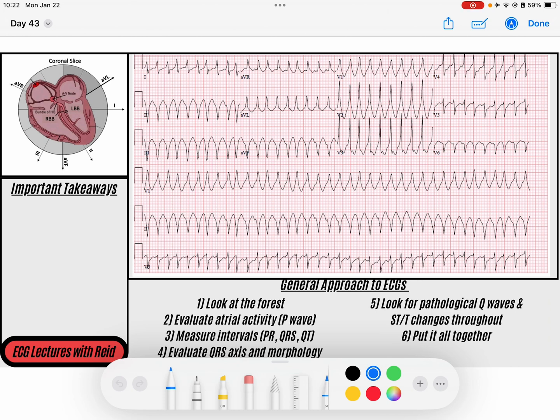The first thing I like to do is look at the forest, and the trees of the forest are my QRSs. You'll notice here that we've got a wide complex QRS that is occurring quite regularly. There's maybe a couple beats that occur a little bit irregularly, but generally it's a pretty regular QRS here and I would say this is a very rapid rate.